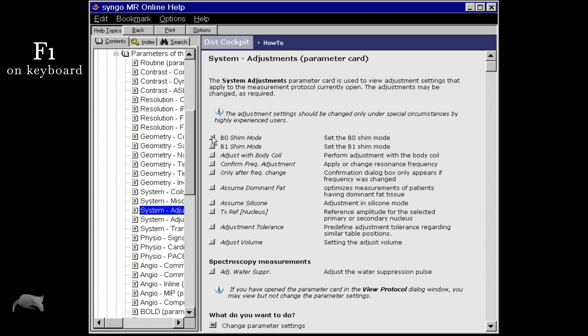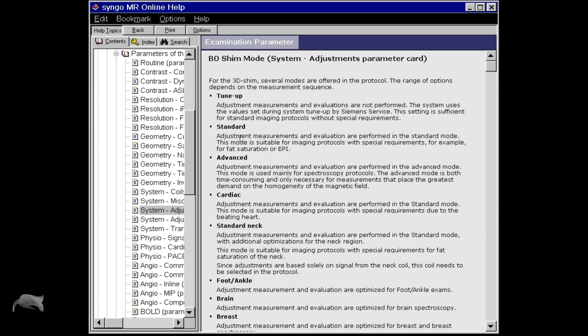And if you want to read more about the system adjustments, whenever you're inside that parameter card and you want to know more about different parameters, just push the F1 button. Then you get into the syngo MR online help, and you can scroll through the B0 shim right here and read more about the different shims and what it's all about.